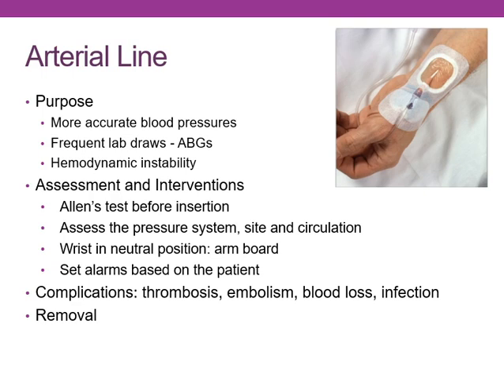So what are the complications? Thrombosis, embolism, blood loss, and infection. The system should stay closed. It's hard to see in this picture, but right up here is a stopcock, so that is where we're going to draw blood. And we really are using what's called the VAMP system, which is a needleless system. So the vacutainer goes right on that. You stick your tube on it, and we're not having to use needles, syringes, and it's actually keeping a closed system. And the blood is pulled back through the catheter, and then we can give that blood back so we're not having problems with blood loss.